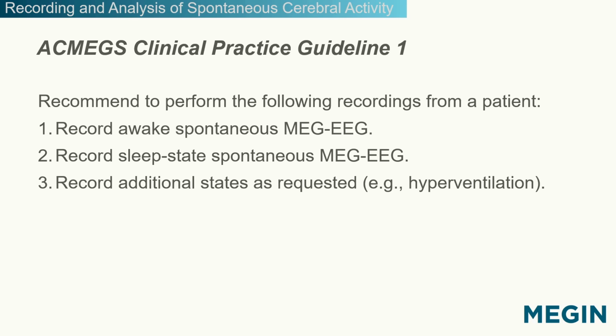Record awake spontaneous MEG, EEG. Record sleep state spontaneous MEG, EEG. Record additional states as requested, for example, hyperventilation.